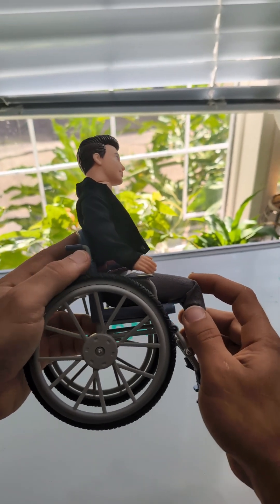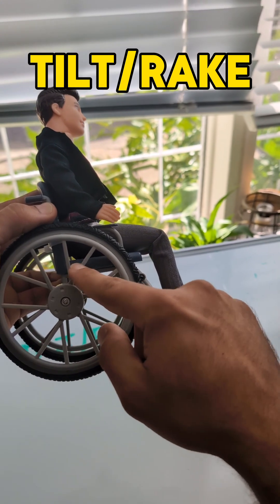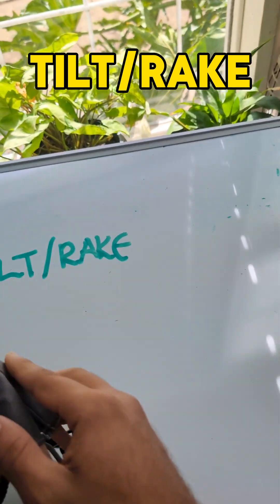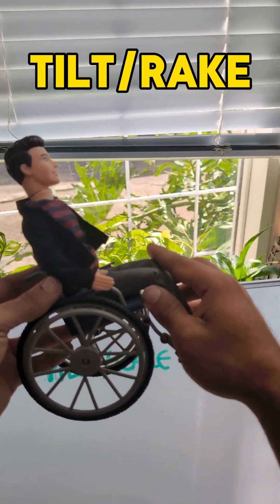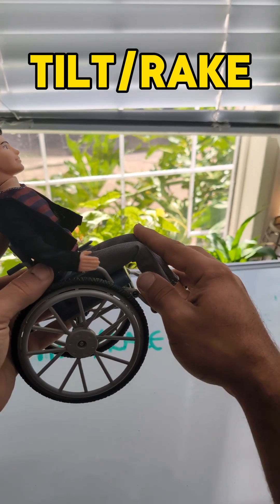Another thing you want to utilize is tilt or rake in the chair. Rake is the distance between the front seat floor and the rear — you can see this chair is quite flat, but we want a bit of a slope to stop someone's hips from sliding forward. That's rake, but you can also use tilt. If the chair has tilt, you want to make sure the client is always in some level of tilt while driving, so gravity is working with us by keeping them back in the chair.